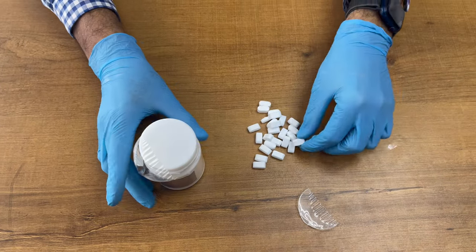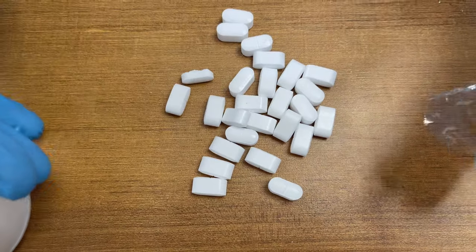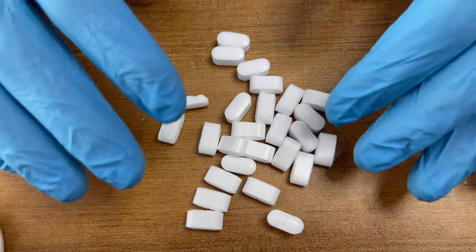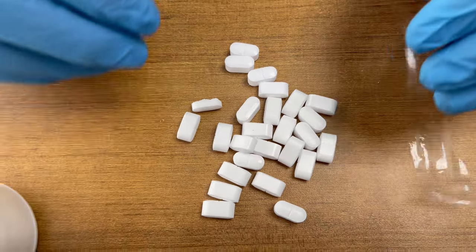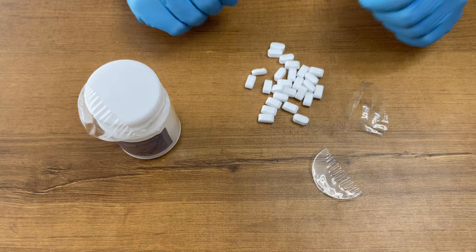You just need to seal it like this. This is how the formalin tablet looks. It is a self-vaporizing tablet, so you just need to put it inside the formalin chamber and it will automatically vaporize on its own. Thank you.